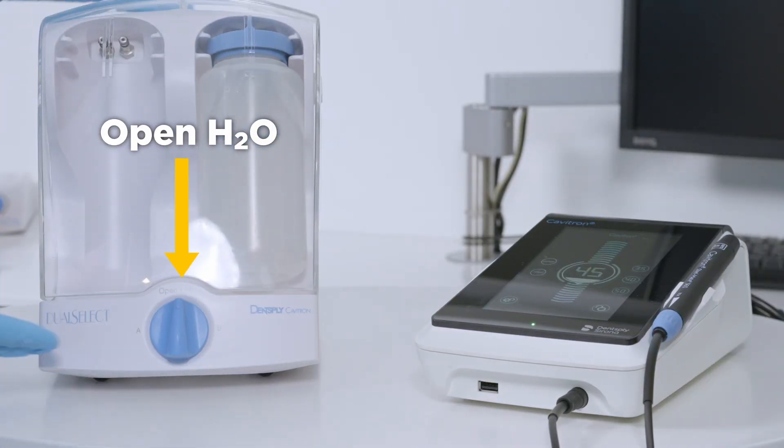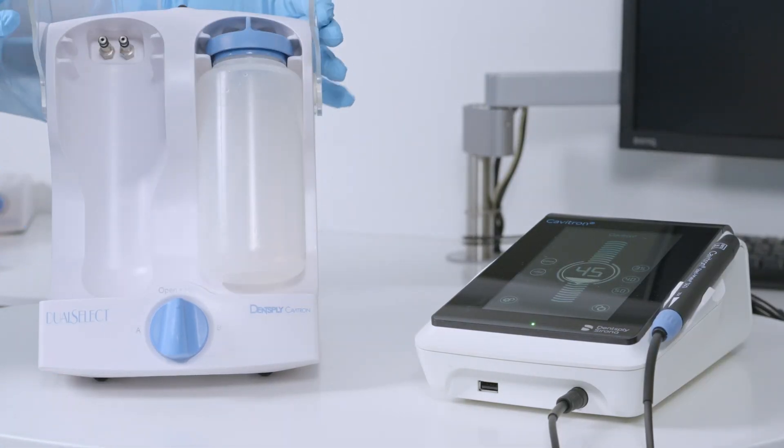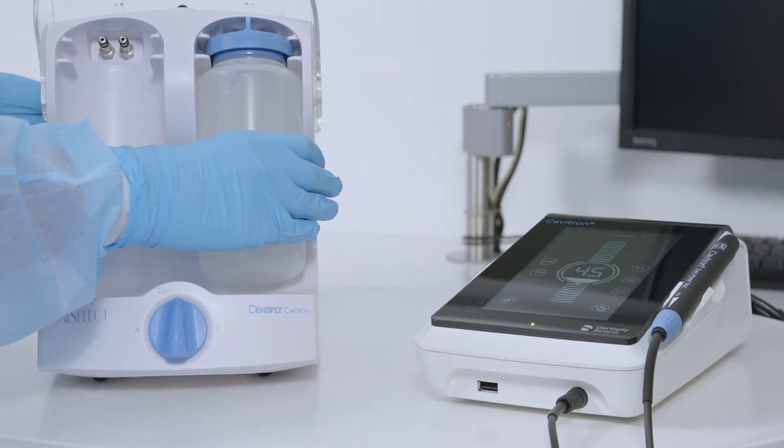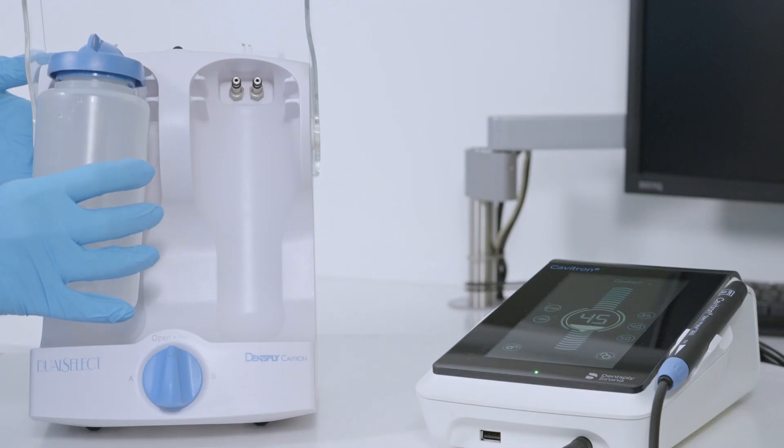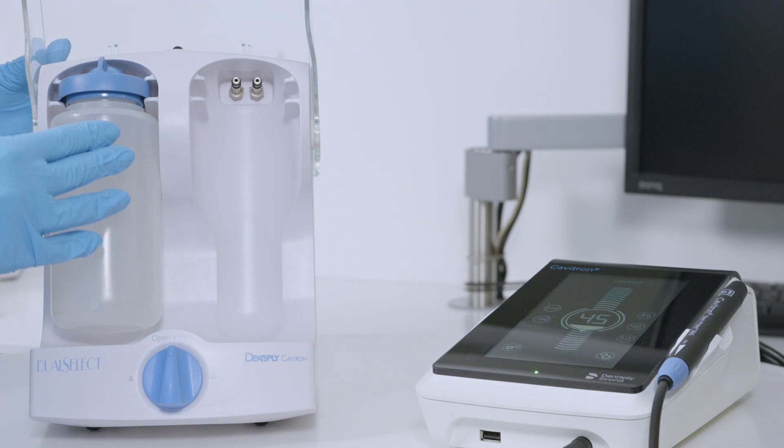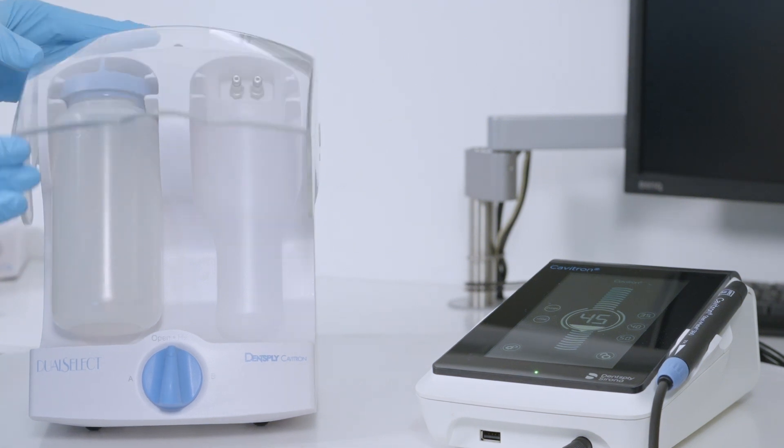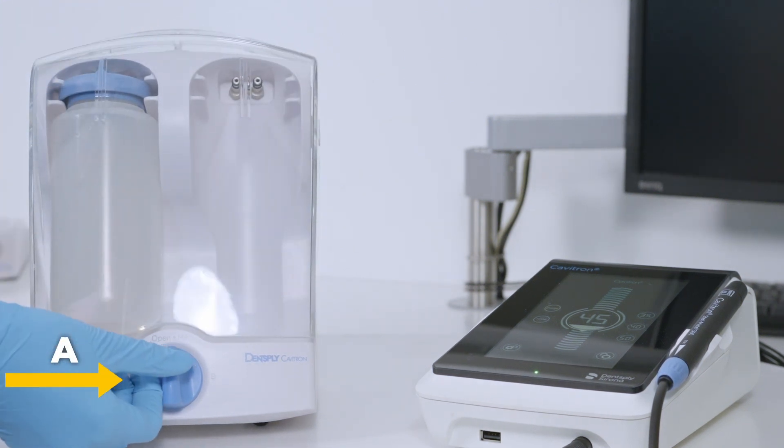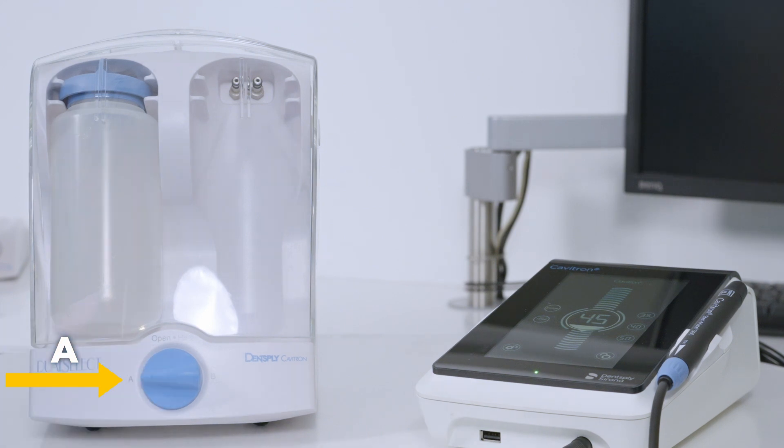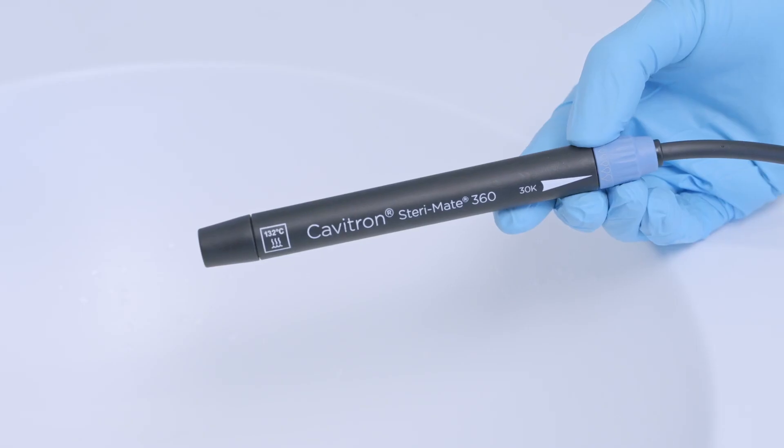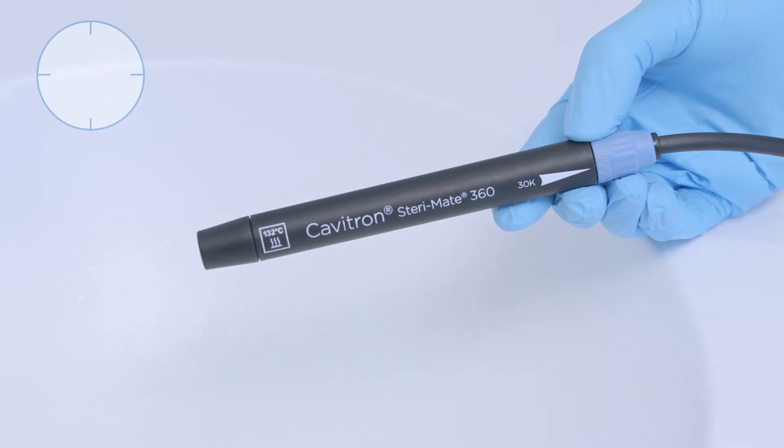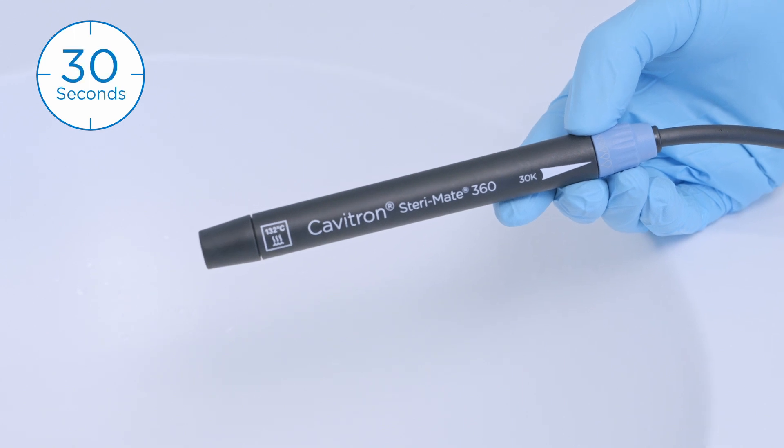Set the selector knob to open H2O. Open the shield and remove the empty bottle from position B. Place the empty bottle in position A, close the shield, and set the selector knob to position A. Operate the Cavitron system at maximum water flow for at least 30 seconds to air purge the line dry.